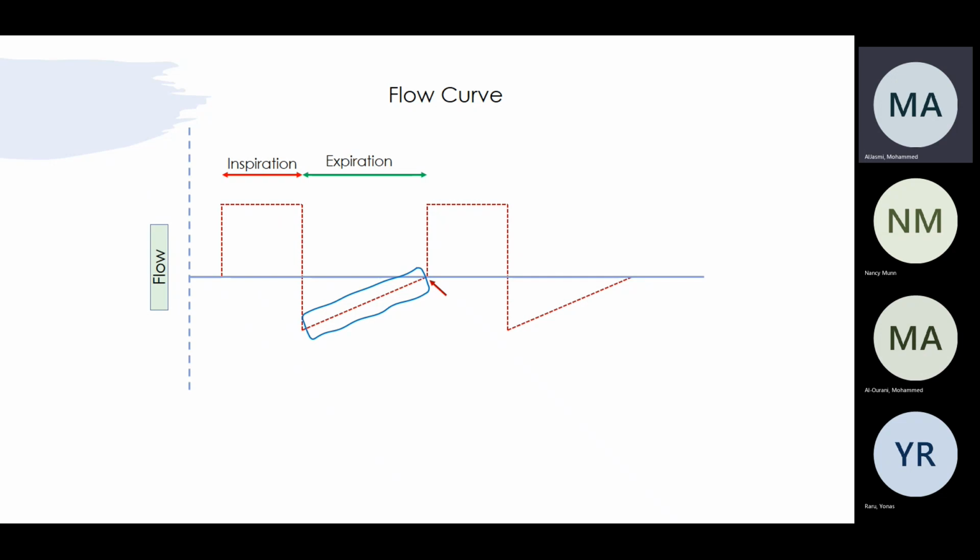That's right. So it will go up at the beginning because of the difference of pressure to reach the peak, and then because the pressure starts equalizing, the difference between atmospheric pressure and my lung pressure, the flow starts going down slowly. So decelerating flow, not the constant square flow. So that's what we are doing, constant square flow in here. If you're rounding with me, I like to put the patient in constant flow even for one time. Why is that? Is it just because that's how I trained, or why do I like to do that?